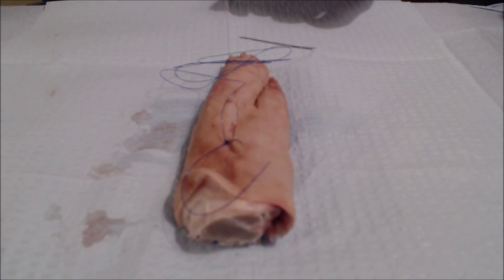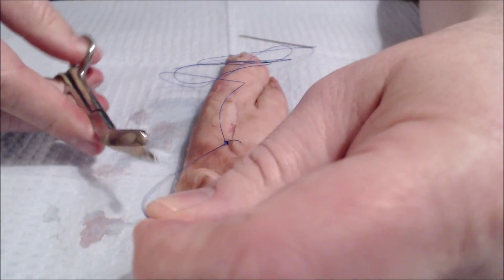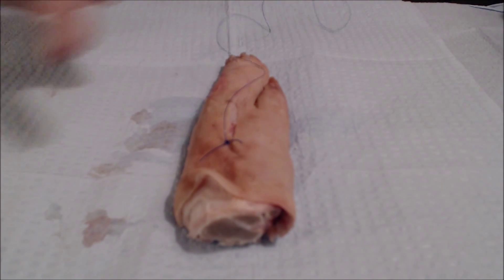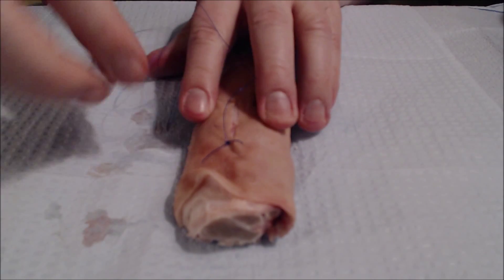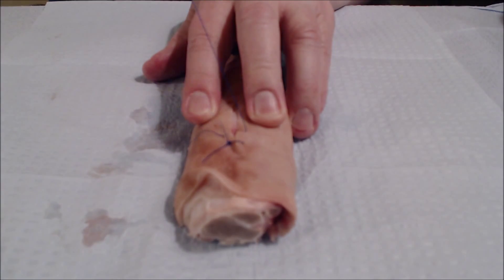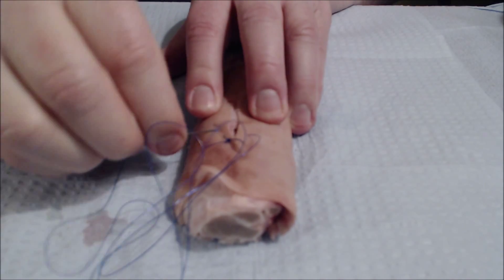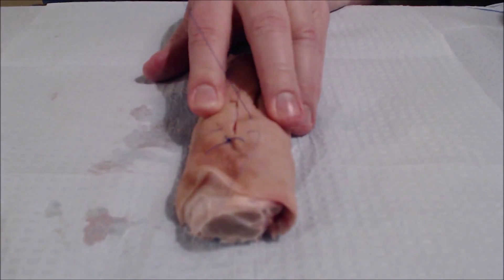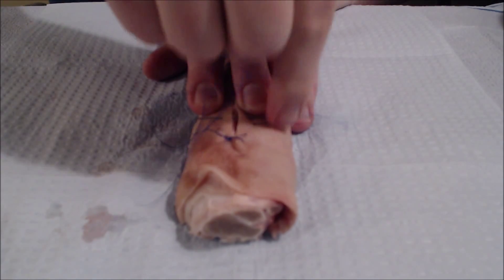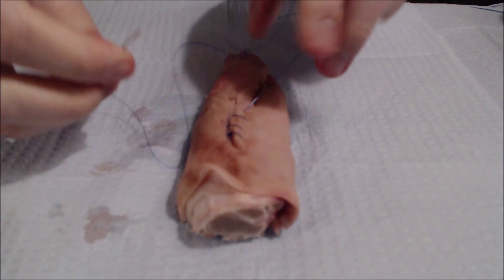In the previous video we cut both ends — we're not going to do that this time because this is a running suture. I'm going to leave an end there, and now I'm going to stitch it up kind of like you would sew something together. We'll place a suture through and just continue doing this the entire length of the laceration. It's kind of a crude technique but it works, and it's expedient.